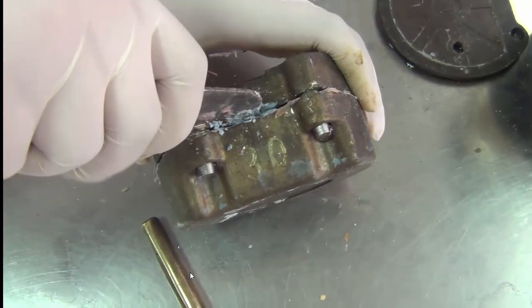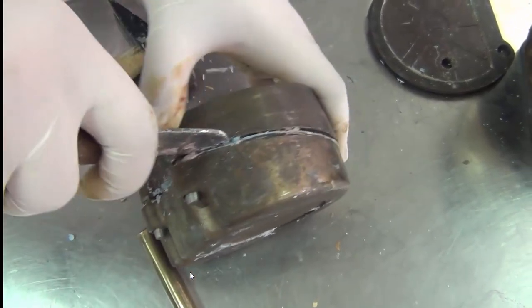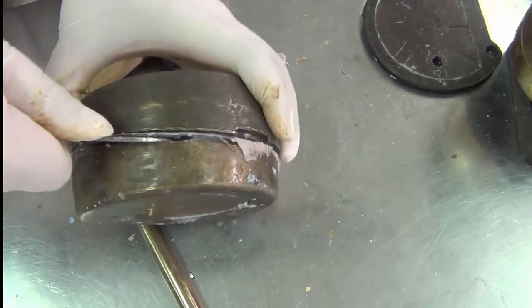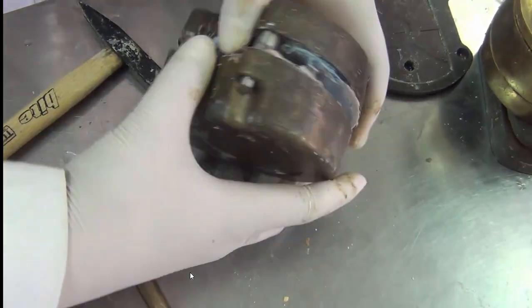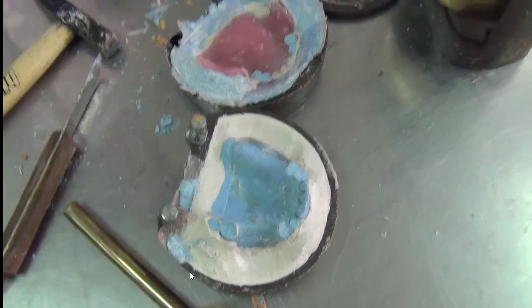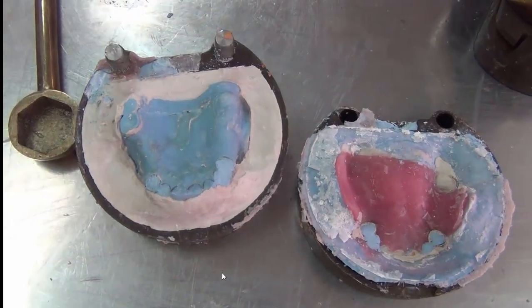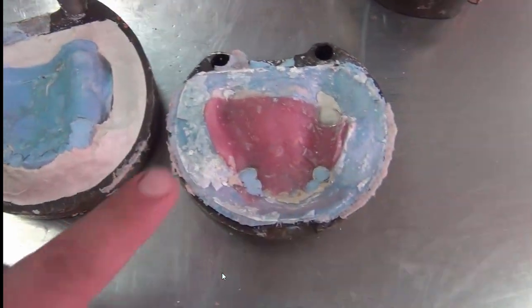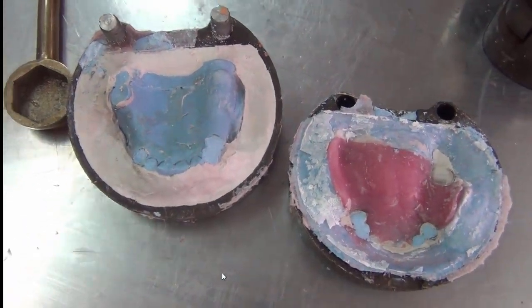Once we see part of the separation there, we begin wedging the plaster knife between the layers. We have some separation now. And you notice that wedging the plaster knife in between the layers and separating them becomes a bit easier. And now we can go between the other parts of the metal, wedging in between. Now this is a good opening where we have separated the casts at the junction between the plaster and the stone layer. So this separation happened in a good location between the middle layers, between the plaster and the stone. The cast is not broken, it's intact, and we might use that for checking our margins during the procedure.